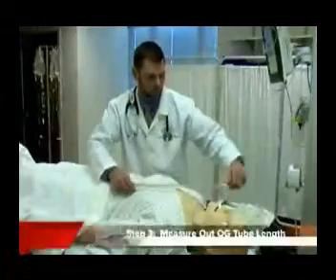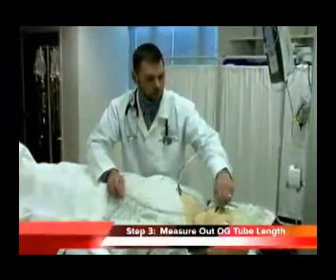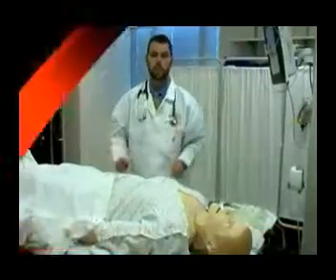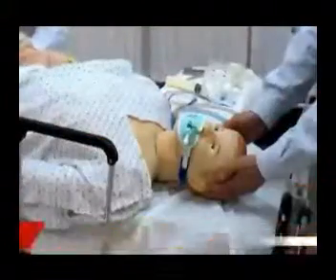Step 3. Measure out the length of OG tube you need to reach the stomach and lubricate the tube with hydroxycellulose jelly. Step 4. Position the patient.